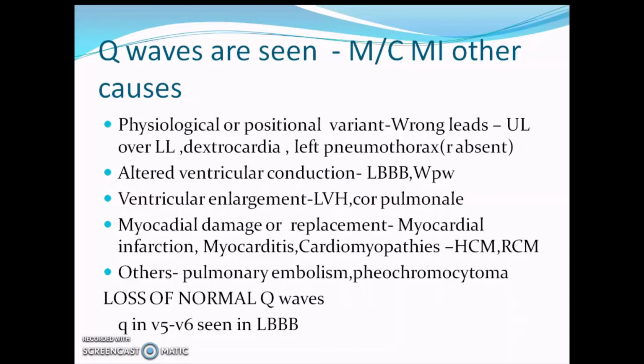So these are the differential diagnoses of Q waves. But what you need to differentiate is whether it is a physiological or a pathological Q wave, and whether the pathological Q waves are due to myocardial infarction or other causes.